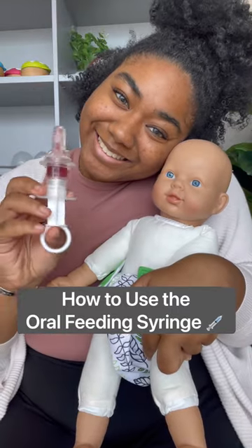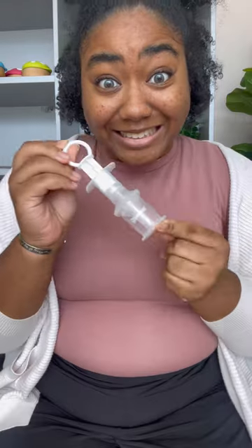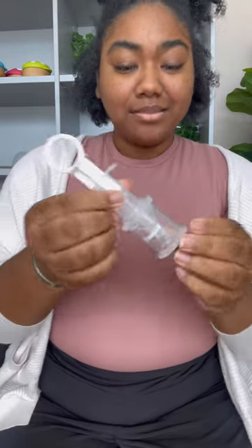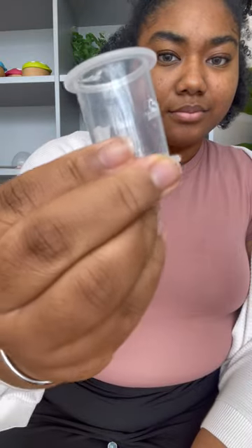It's cold and flu season, so today I'm going to walk you through how to use the oral feeding syringe by Haka. The syringe comes with a measuring cup for Bub's medicine. It goes up to 20 mils in 5 mil increments.